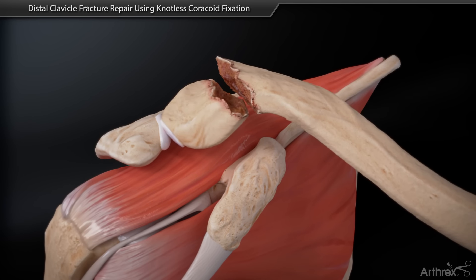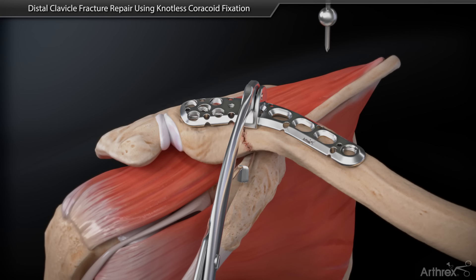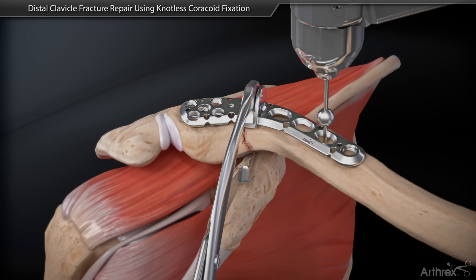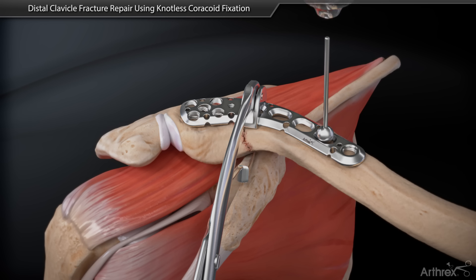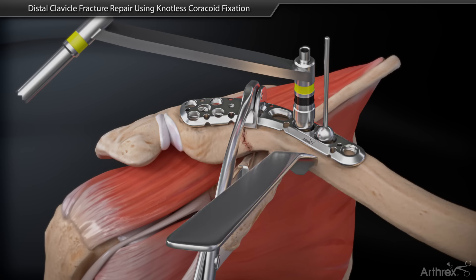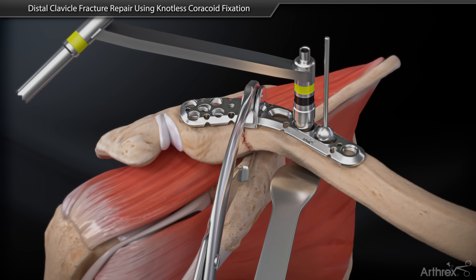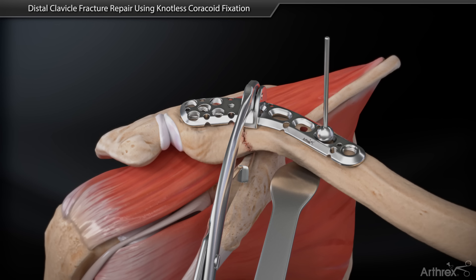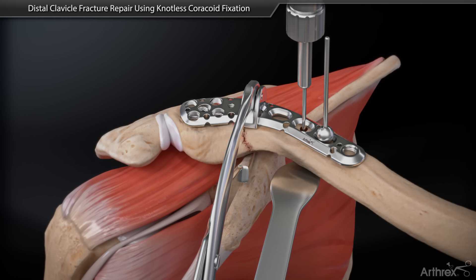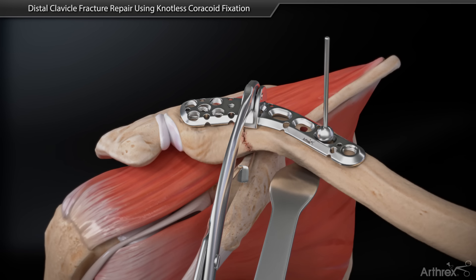Reduce the fracture and temporarily fix the pre-contoured plate onto the clavicle. Place the drill guide into the appropriate plate slot and drill a bicortical hole. Measure for the screw length and insert the screw until it seats flush into the plate.